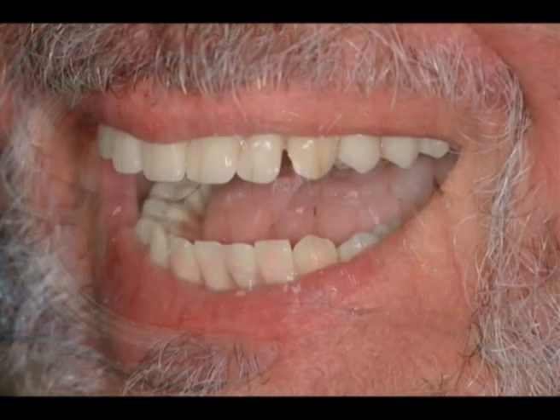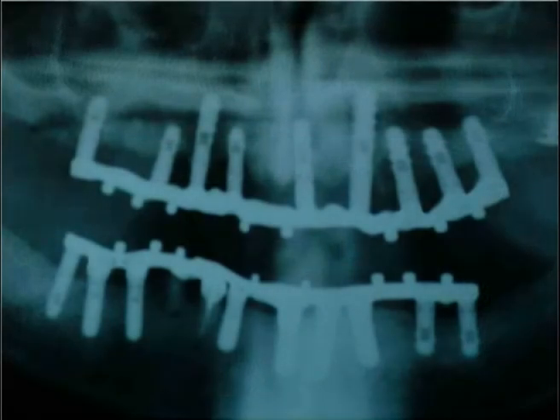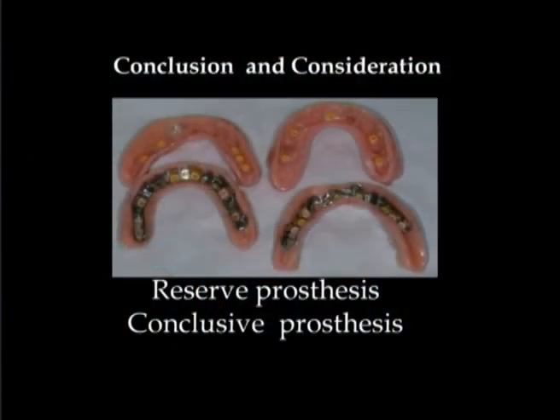Denture in the patient's mouth, centric occlusion. Patient smile. Final checkup X-ray. Two additional second dentures with no cast reinforcements are requested by the patient for his peace of mind.